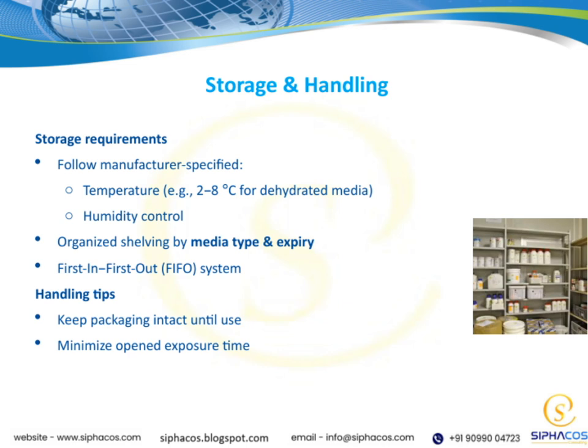Organizing your shelves by media type and expiry date makes it easier to find what you need and ensures you're using the oldest supplies first. Implementing a first-in, first-out system is a great way to prevent wastage and ensure freshness.